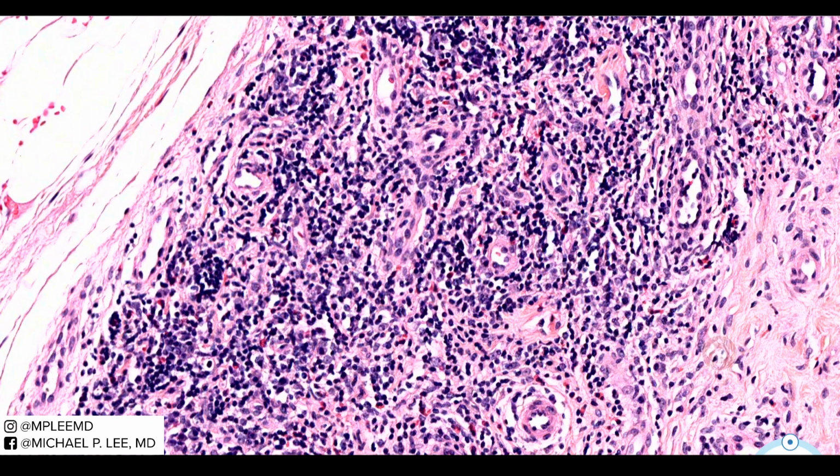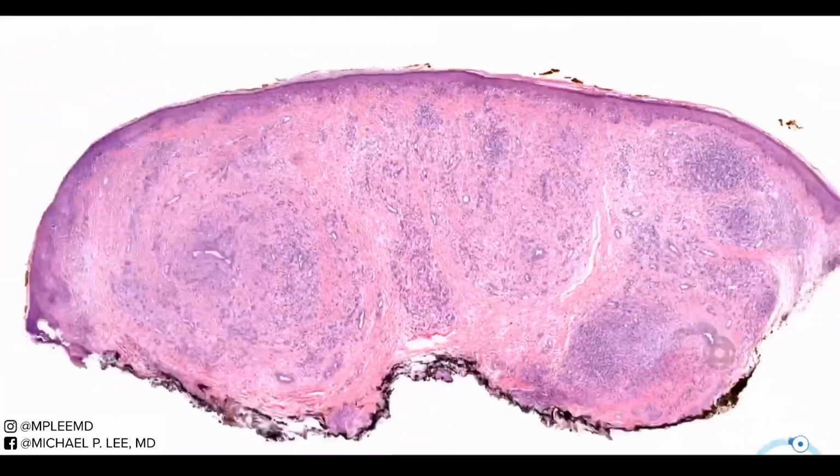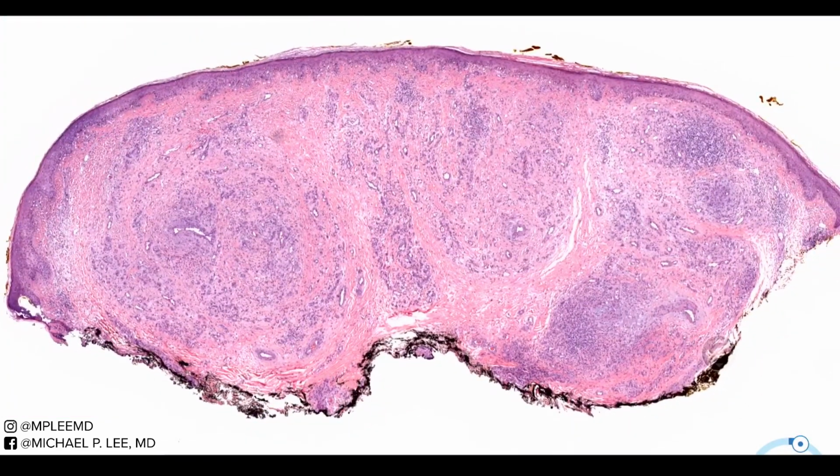Okay, let's look at another example. All the cases today are actually taken from PathPresenter. I didn't have any of these cases when I decided to teach this, so they're a great resource. They have a slide library that has a bunch of cases. I would certainly suggest you go over there and take a look yourself.